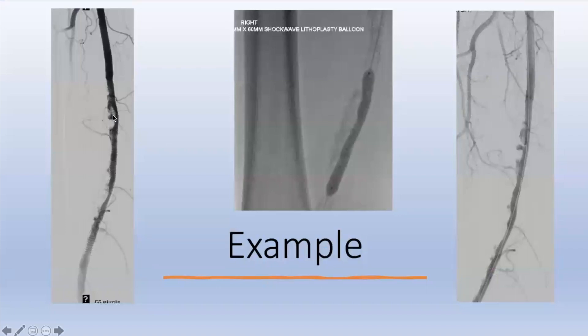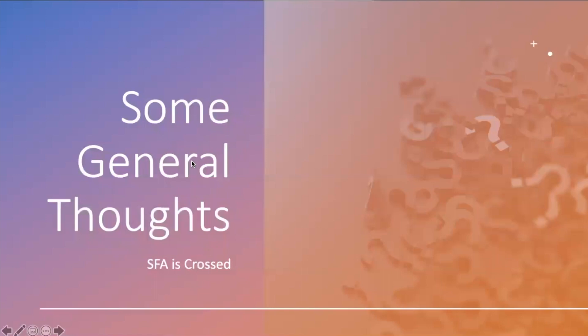This patient has really chunky calcium in the distal SFA and proximal popliteal — previously stented above and below. You can see the balloon at four atmospheres trying to create a lumen, and even though there are chunky areas, the lumen itself is actually better. I've been getting a lot of use out of shockwave. There are real benefits in certain areas and it's something we're going to learn more about.